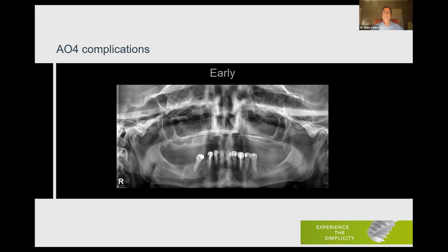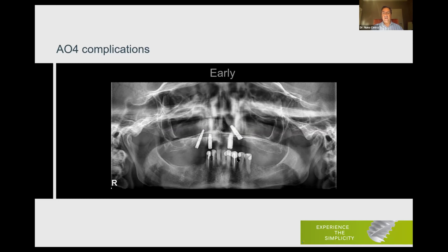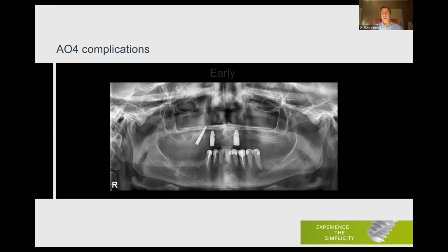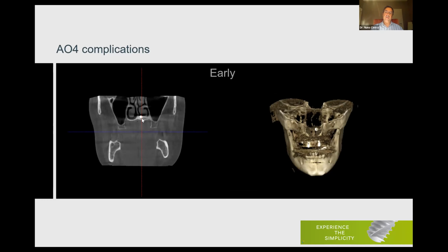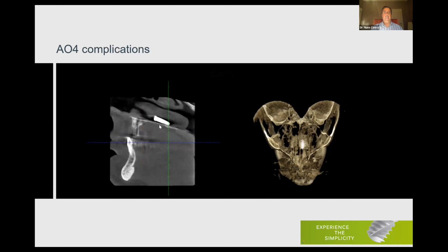A situation like this, we are talking about complication. Very nice X-ray for an all-on-4. That's what we did. And suddenly, this implant starts moving, starts migrating until it disappears. Well, if you look closely, it didn't disappear. Can you see that? That's not a nasal piercing. That's our implant on the floor of the nose. As you can see it there, and as you can see it there. So the implant migrated to the floor of the nose.